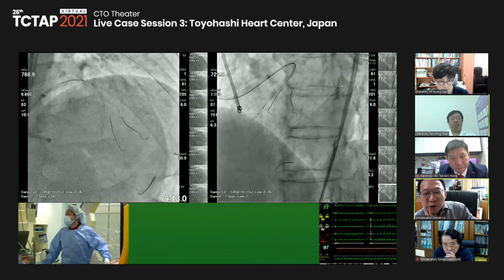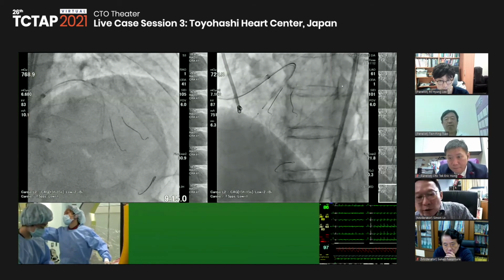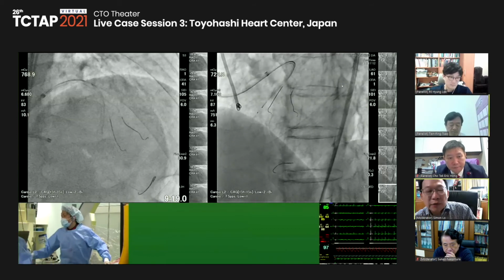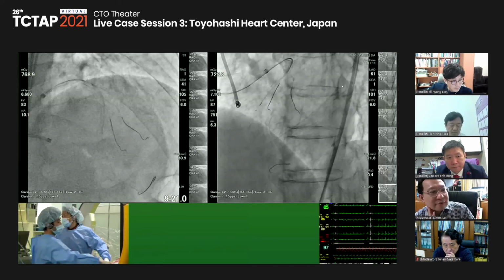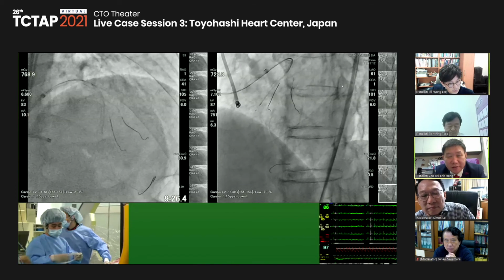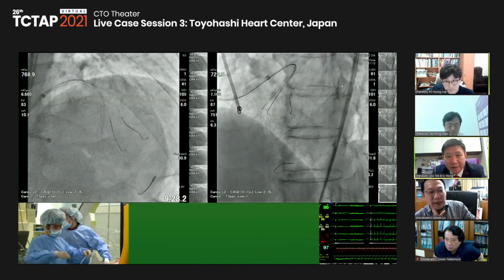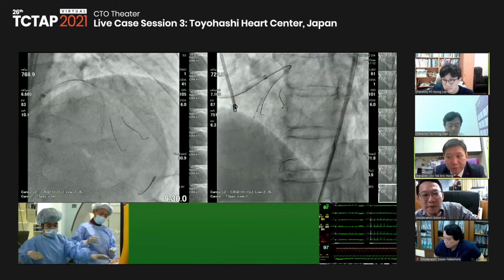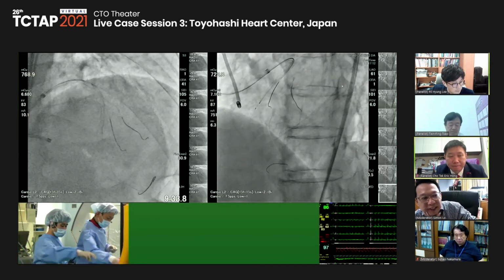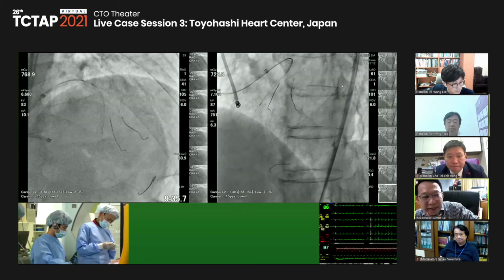Dr. Hong, would you also do a kissing balloon first into the first diagonal? Would you bother doing a kissing balloon with a 2.5 balloon into the second diagonal? I think in my practice, I would actually kiss the first diagonal and then subsequently POT proximally as big as you can. And you see the second diagonal wire is still outside the stent.